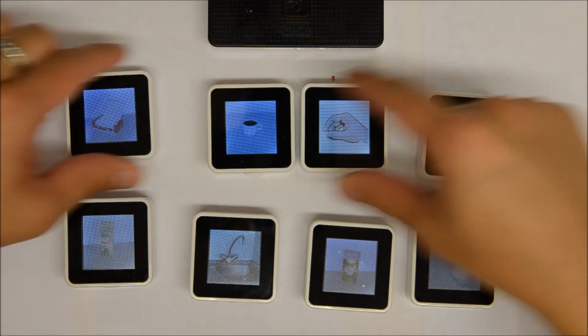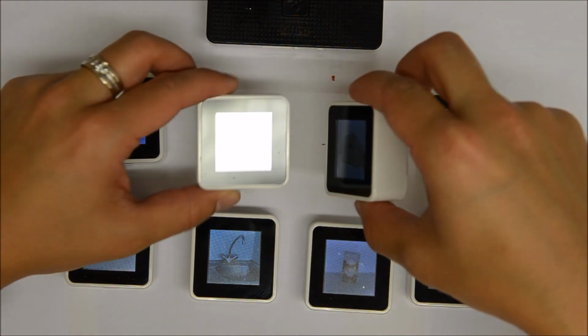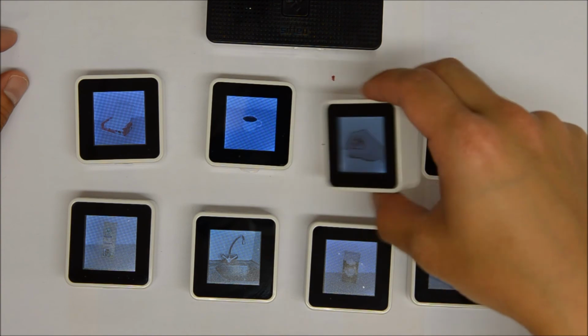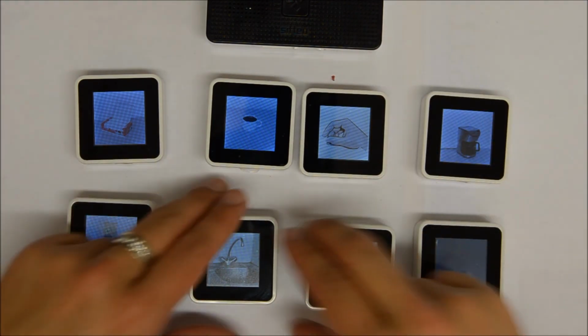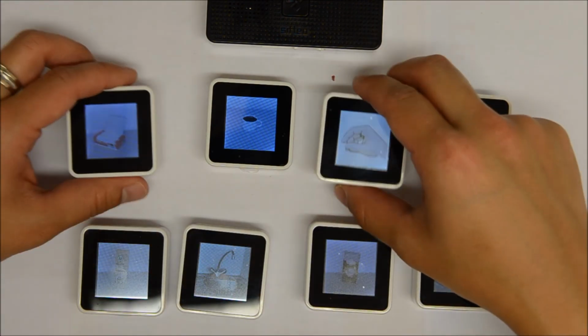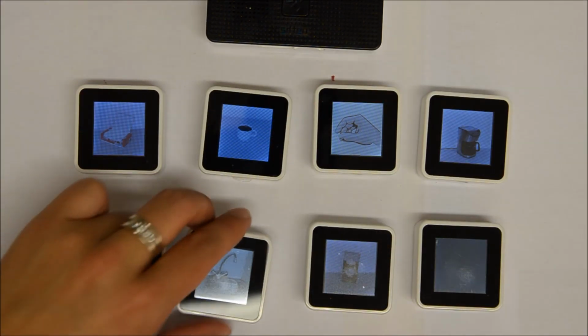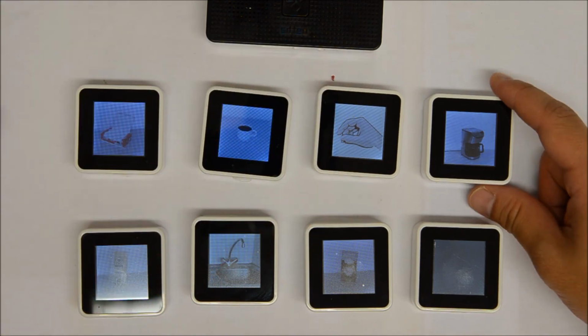So overall you can see there are many kinds of interactions involved. You can touch each of the cubes itself. You can bring 2 cubes together using the proximity sensor, and you can also use the accelerometers, so you can tilt the cubes and do an action such as pouring. So it's a lot more interactive. The cube is very tangible. You can hold it in the hands. And the screen size is reasonably okay to display small household items.